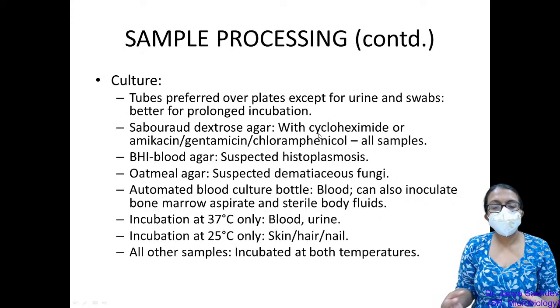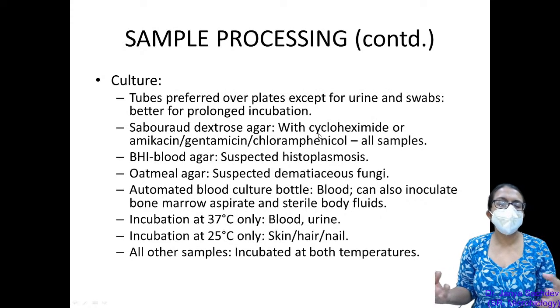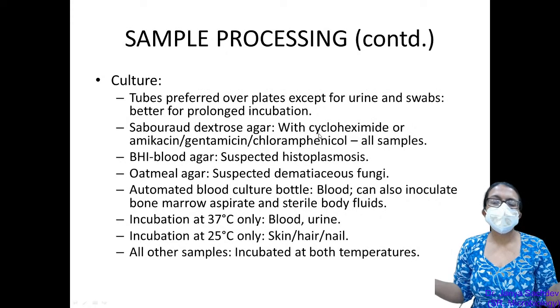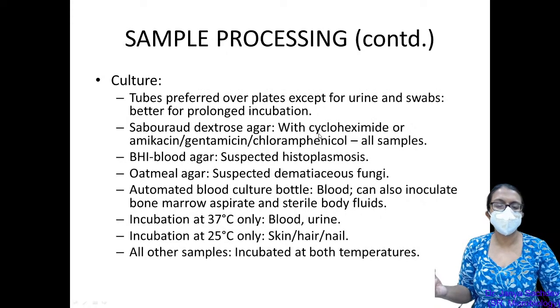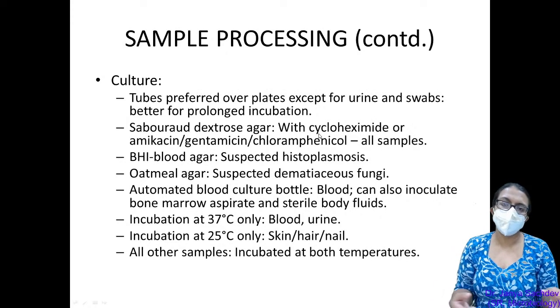However, the limitation of having growth only in culture and not in microscopy is that it can very often be a contaminant. As you know, our environment is full of fungus, and spores are everywhere. Even if a sample was left open for a few minutes on the bench top, or after collection, spores could fall into it from the environment and give you a growth in culture without a positive microscopy.